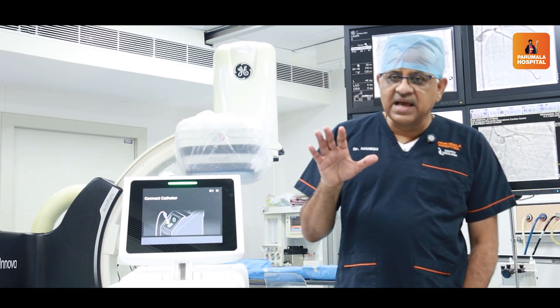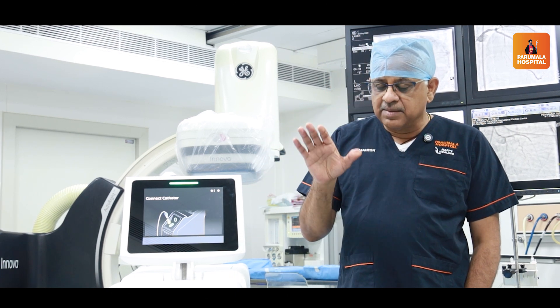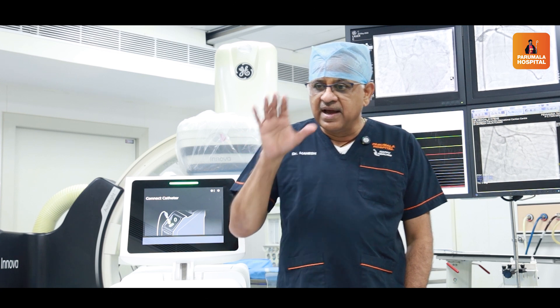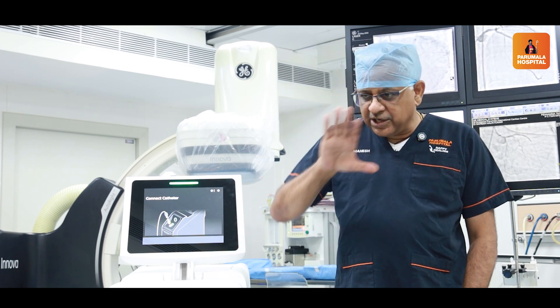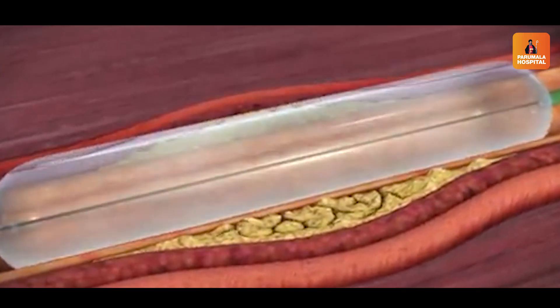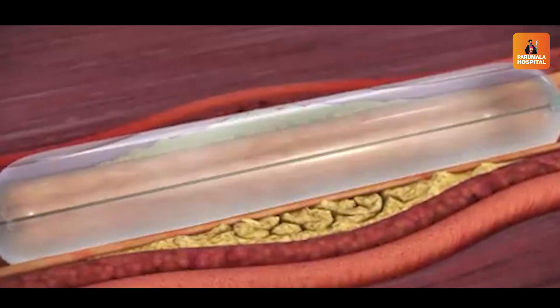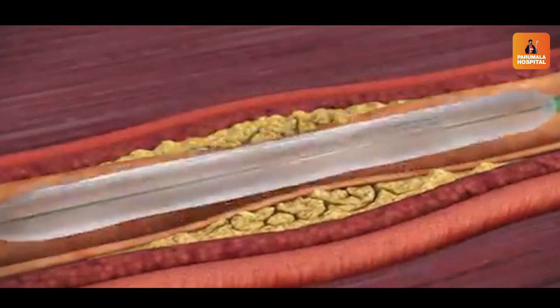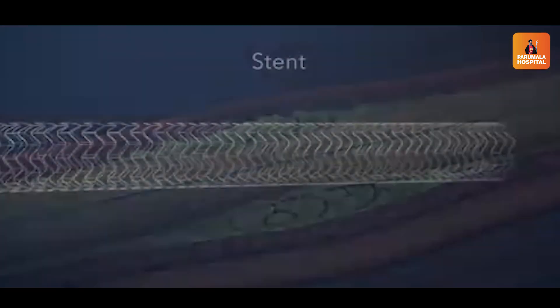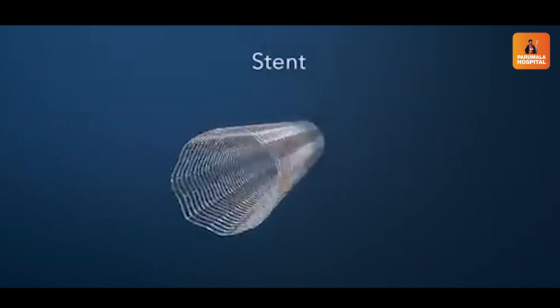To conclude, laser helps you to modify the lesion. It helps soften the block and damage fibrous or clot-laden tissue to make it clean. Laser is not curative on its own — it salvages and prepares the lesion. In the final step, you can also use a drug-eluting balloon after laser treatment.